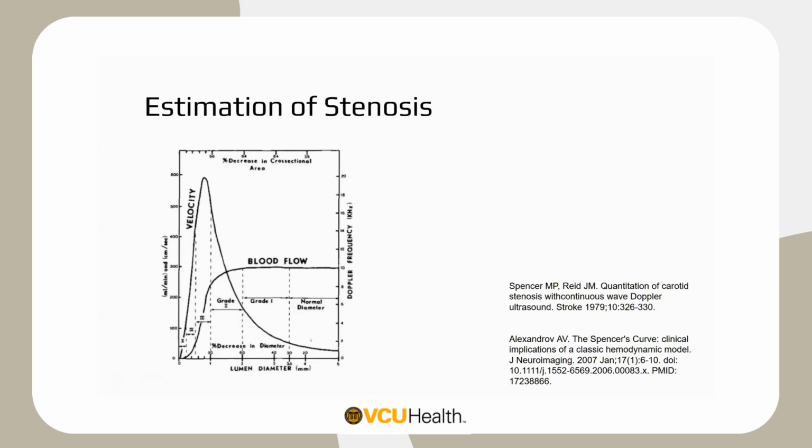increases, going from right to left here, initially the blood flow is able to be maintained. When we get to moderate to severe stenosis, somewhere around the 70% stenosis part, we start to get limitations in flow, and the blood flow begins to decrease with worsening stenosis. Velocity tends to increase throughout this range as the degree of stenosis worsens, until we reach a peak.